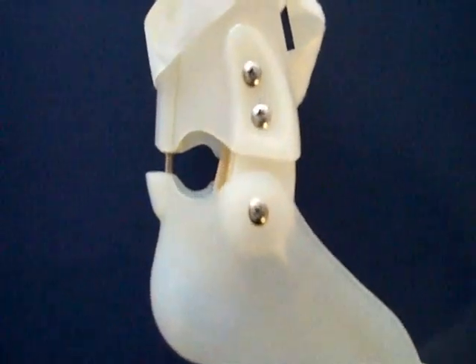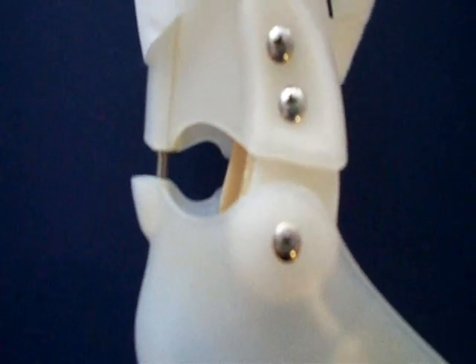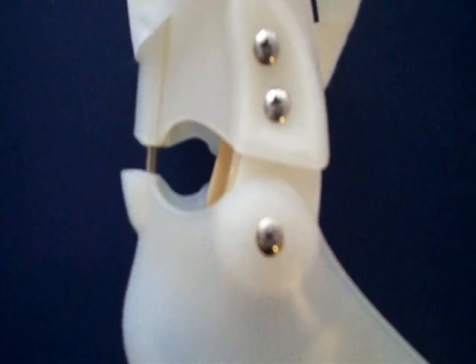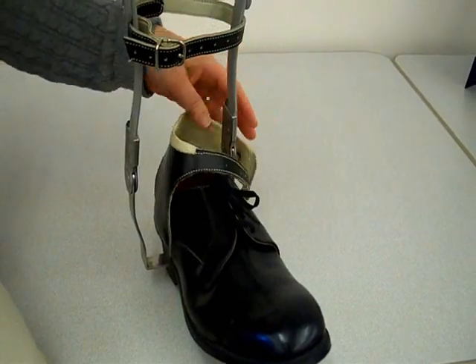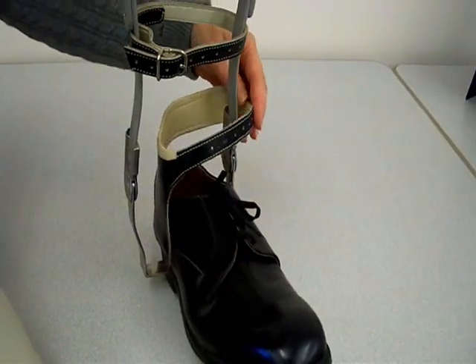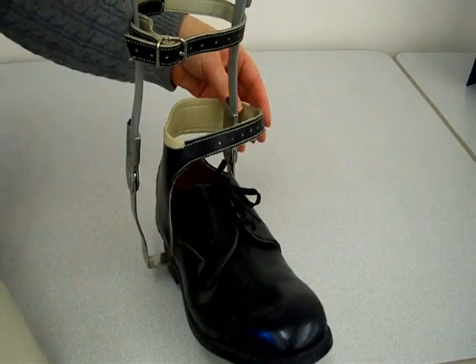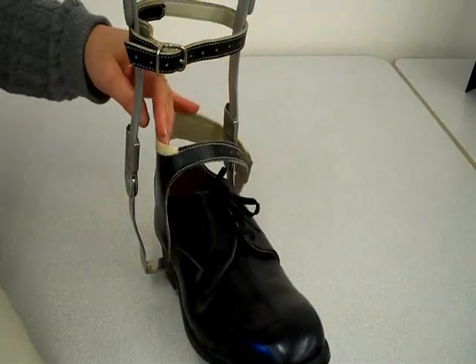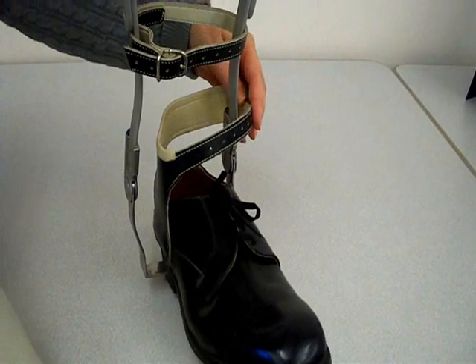You can see the plantar flexion stop in this video. The patient can dorsiflex actively but the orthosis limits the amount of plantar flexion. This video also shows how supination or ankle varus is controlled: an extra flap of leather is against the patient's ankle, and as the ankle tries to roll out, the leather resists because it is buckled around the upright. If the patient had a valgus, the leather flap would be on the other side.